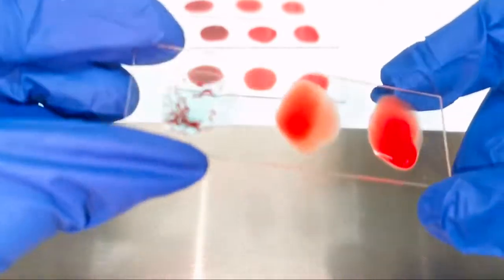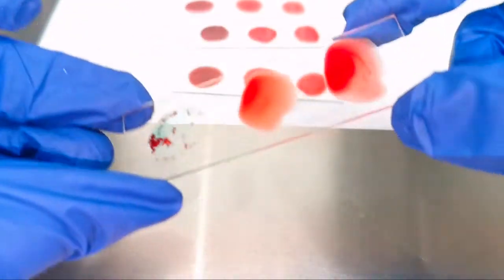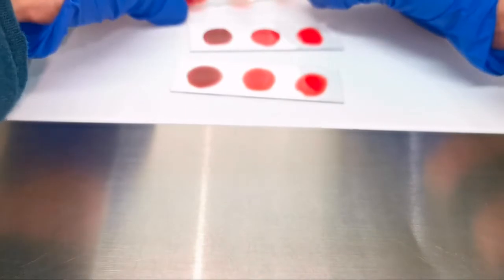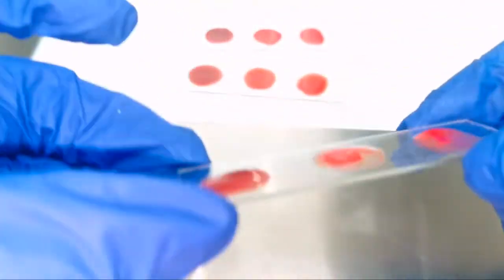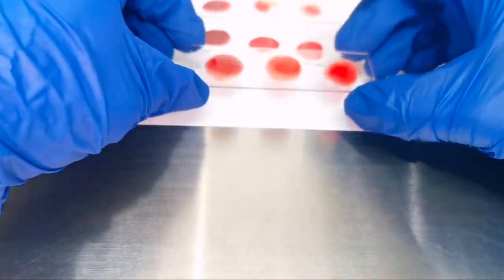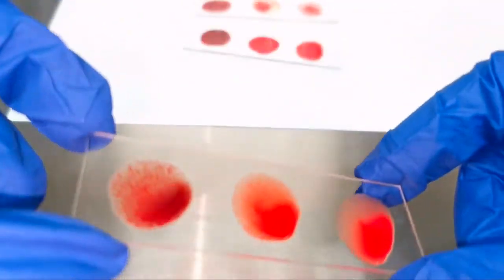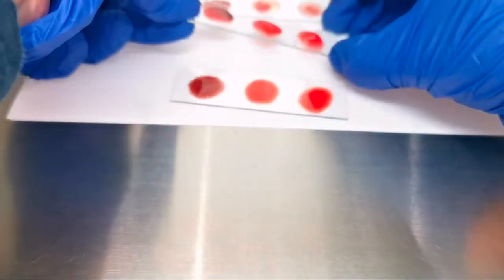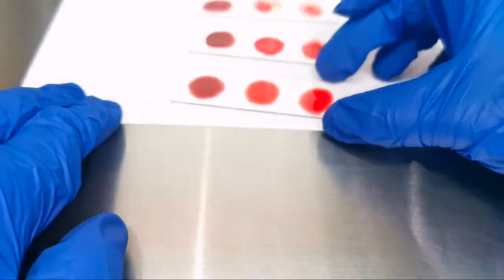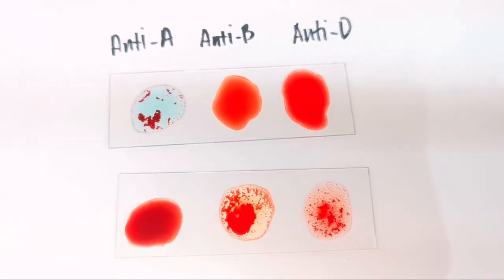Then tilt the slide back and forth for 30 seconds, with occasional further mixing during a 1 minute period of time. Read macroscopically after 1 minute over a diffuse light.